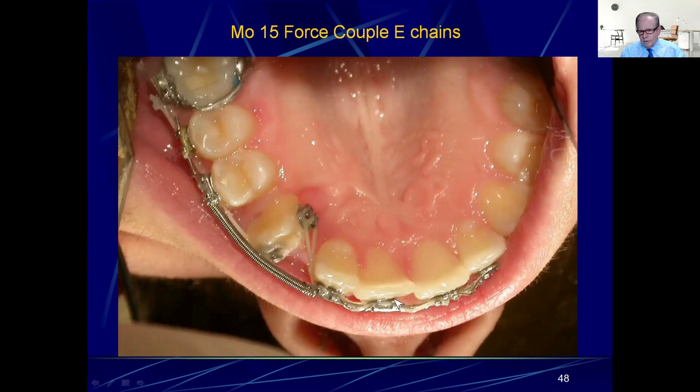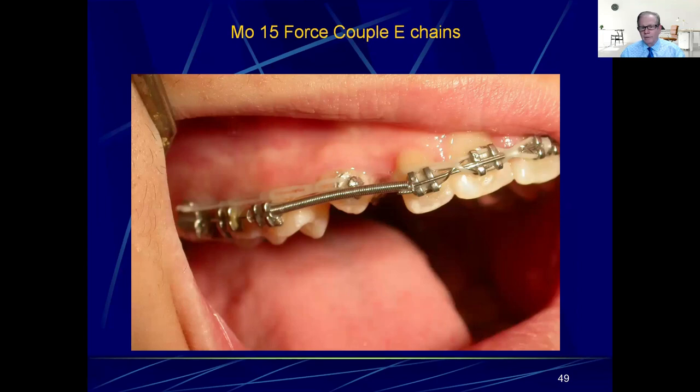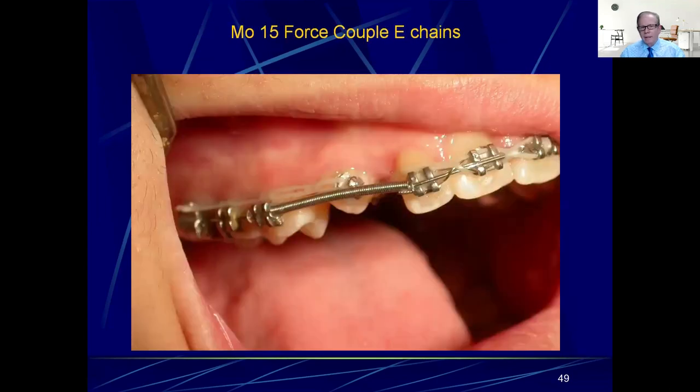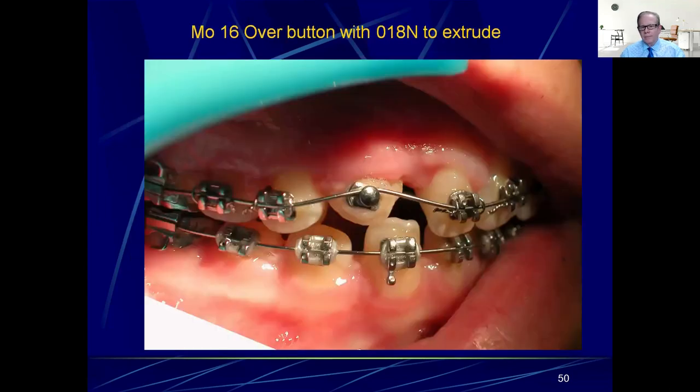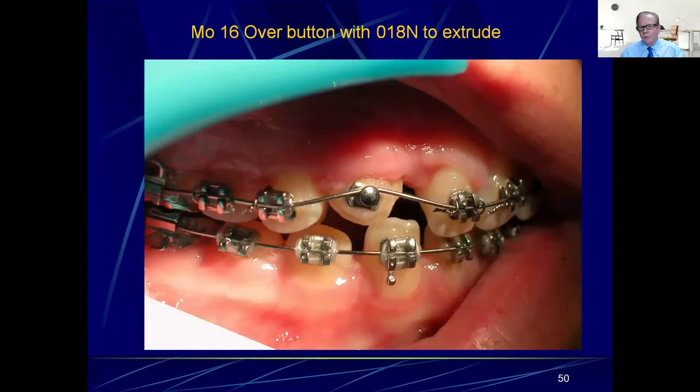Don't worry about the cross central incisor problem; you'll go back to NiTi at some point to fix that rotation. The main emphasis now is to get that cuspid in and rotated. You can see how tight that chain is — one more hole and it would probably break. In 30 days the rotation has been completed, which is exactly what you want to see.